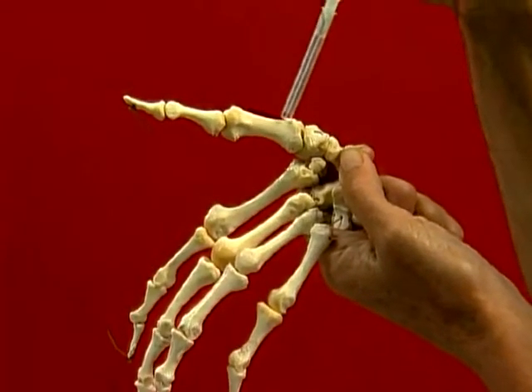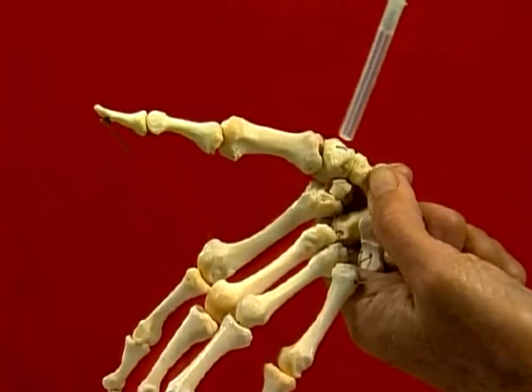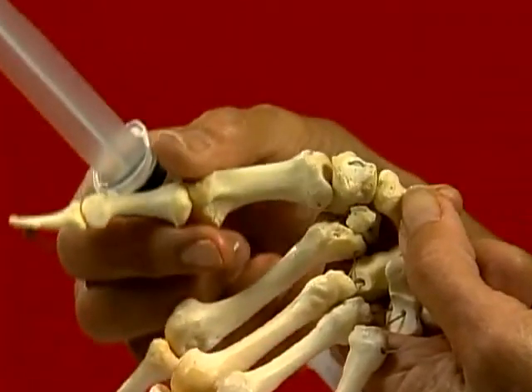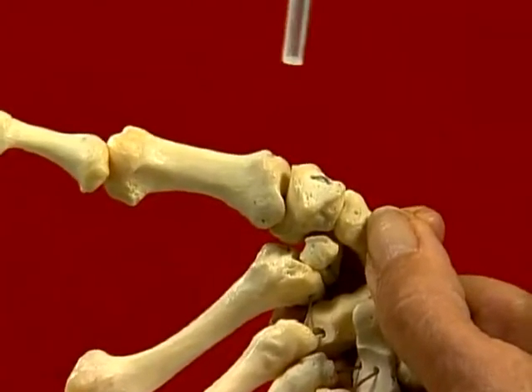Identify the edge of the metacarpal on the radial border and the trapezium immediately proximally. Feel for the gap by opening and closing the joint space, and insert needle perpendicularly into this space.